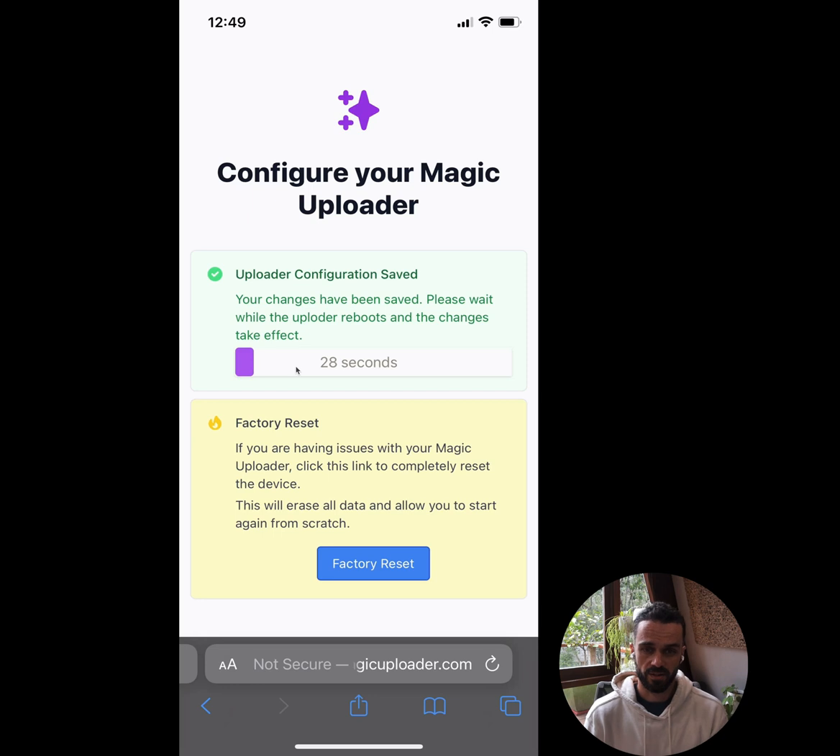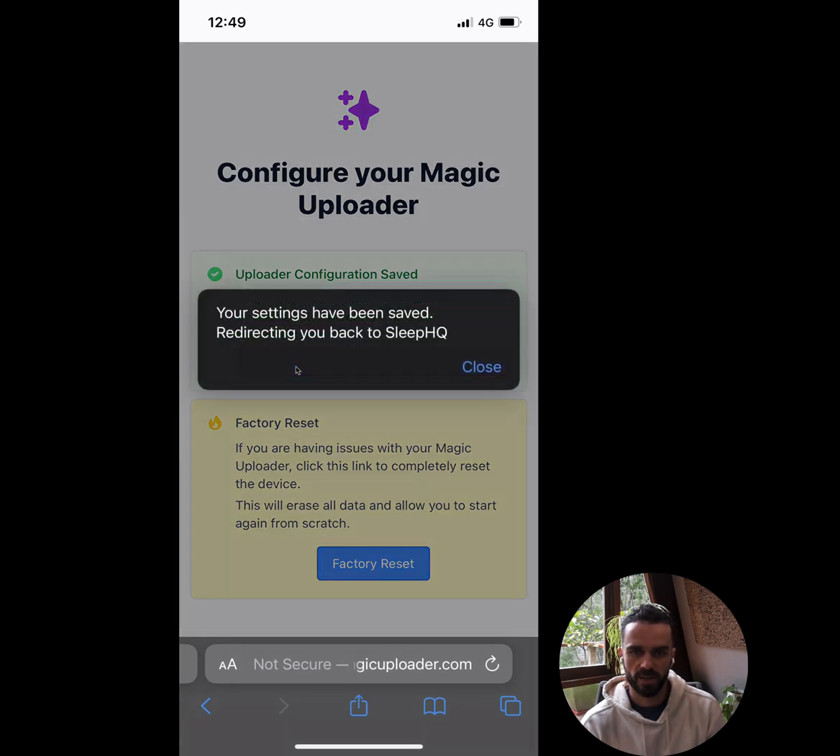Once I've entered my password, I go to country — I'm in Australia so I'll select Australia from the list — then hit 'Save Settings.' It takes about 30 seconds. The Magic Uploader is now going to save those settings, reboot itself, and attempt to connect to my home WiFi network. Assuming that's gone successfully, it's going to redirect me back to SleepHQ and I should see the Magic Uploader automatically appear in my account. Settings have been saved and it's redirecting me back. I'll hit close.